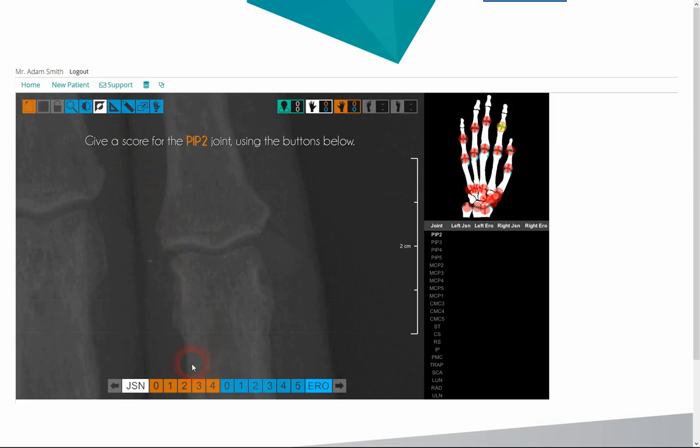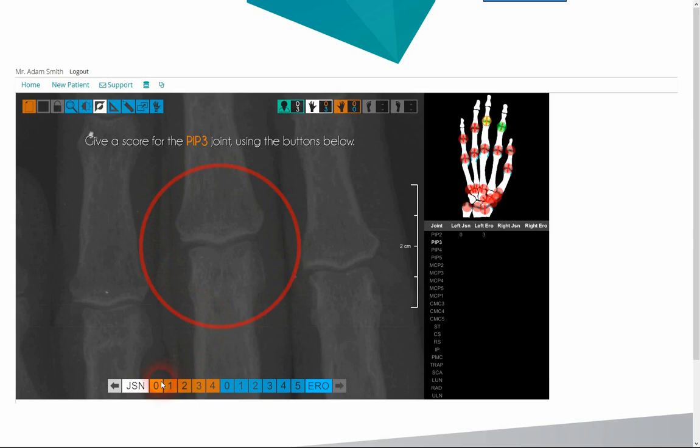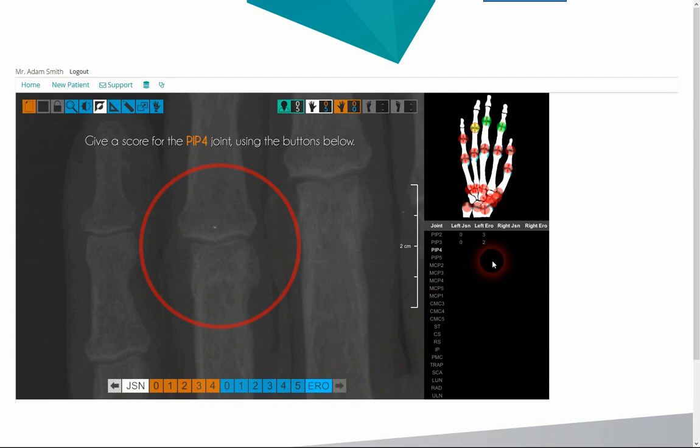On a user-friendly interface, we score the narrowing and erosion of the joint. After this is done, we go on to the next joint. The red circle defines the joint under evaluation, minimising the chance of errors or confusion.